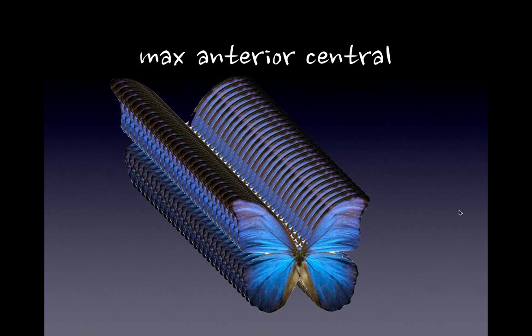Two shades on what continuum by value? I don't know what that means, so please ask the question a little bit clearer. Won't the Vaseline on the cord affect the bonding? No, because the Vaseline is on the cord and it's beyond the margin. It should be beyond the margin. It should not be anywhere near the margin when you're retracting, so that shouldn't be an issue.